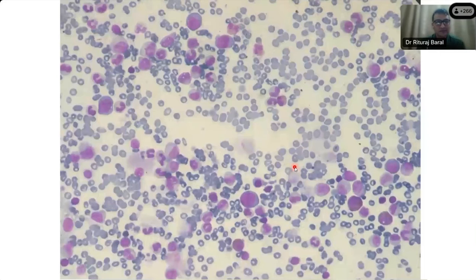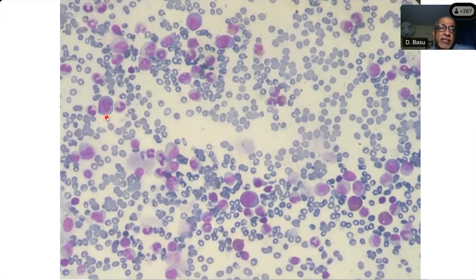Now I'm going to show you a few more pictures, and this is for everyone in the audience. Again, something very similar to what we saw. There's again a pretty cellular field in the marrow. Notice a lot of myeloid cells, myeloblasts, eosinophils, metamyelocytes, neutrophils, and caught up in all that are a couple of those large immature erythroid cells which I'm pointing out, immature proerythroblasts. And in this field, again, I do not see any maturation of the erythroid lineage. Right? Yes, sir.